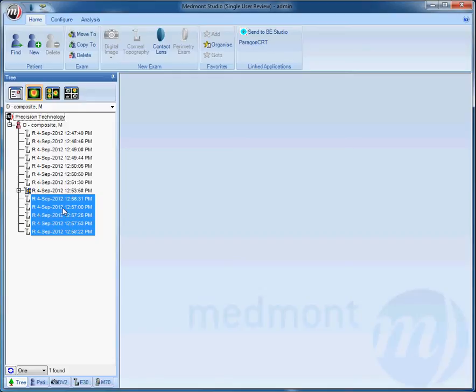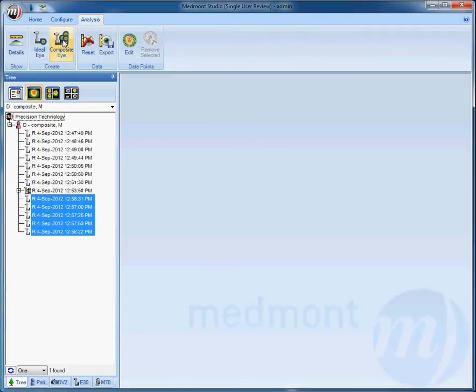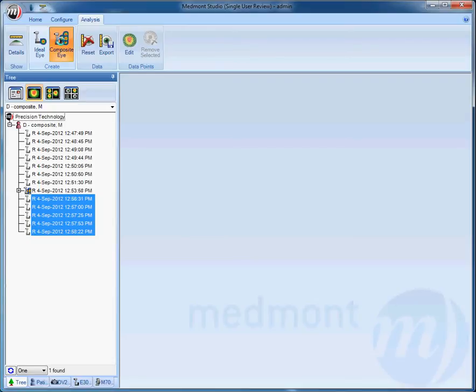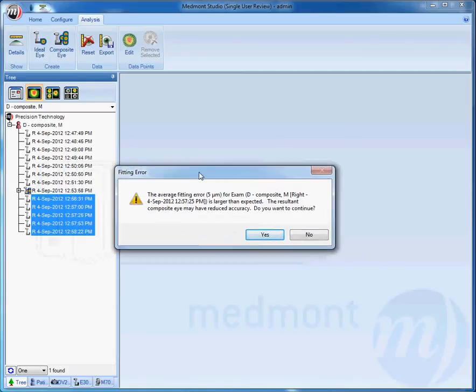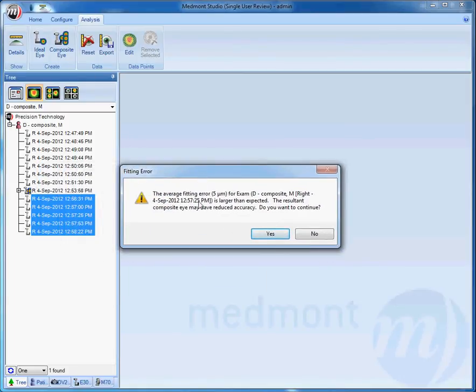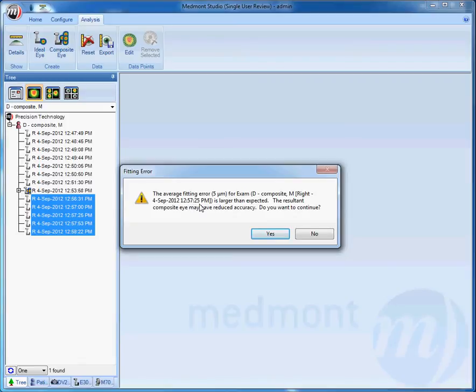When you've got your images highlighted, you can go up to Analysis and Composite Eye. Once we hit Composite Eye, the Medmont software will analyze each one of those images for error to determine if any one or more than one should be retaken. Once I click Composite Eye, you'll notice the software has analyzed all the images and determined that the image taken at 12:57:25 PM has an average fitting error of 5 microns.